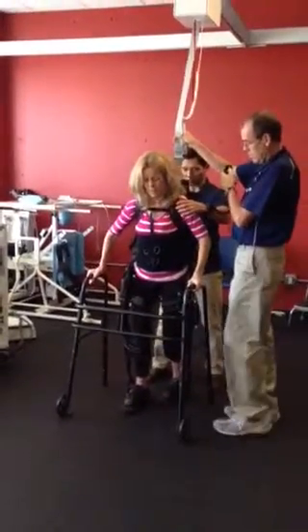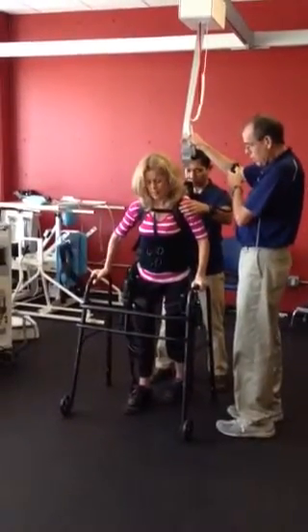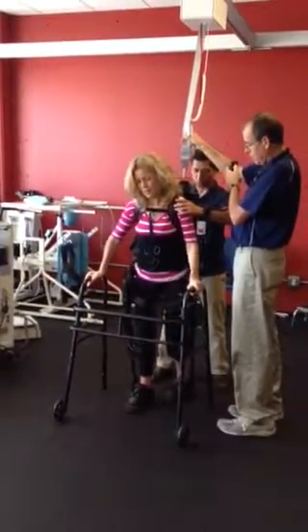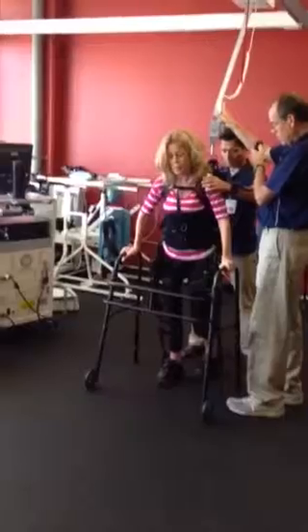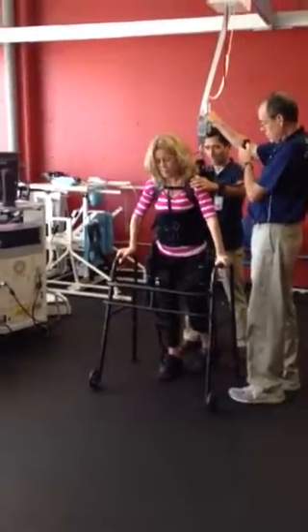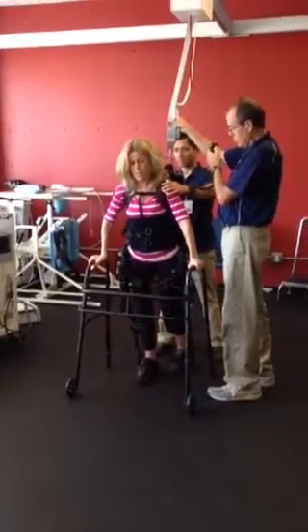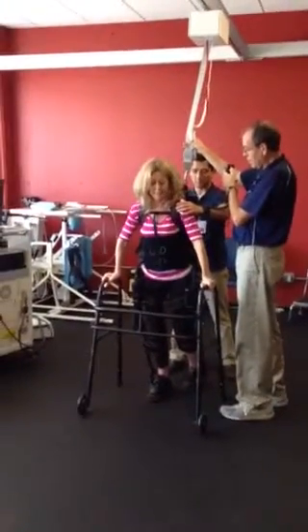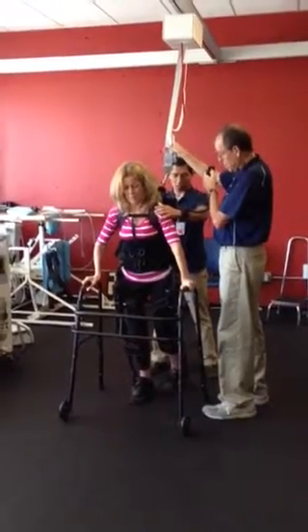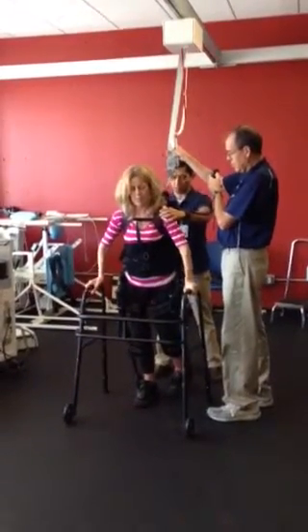Get that walker forward. Walker first. A little bit more. There you go. Now put your weight over that right leg. A little more right. Right there. See how? Use your arms. I'm sliding. A little more forward. Put the walker back. I got you.